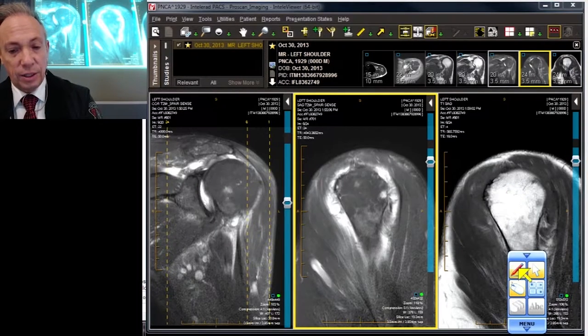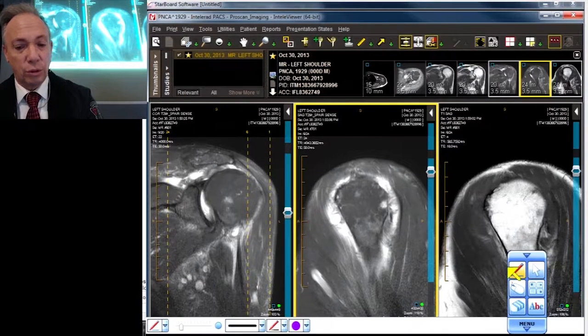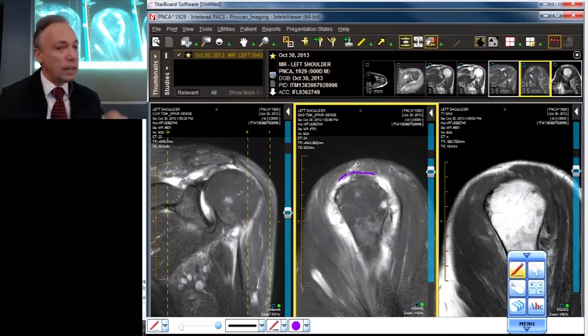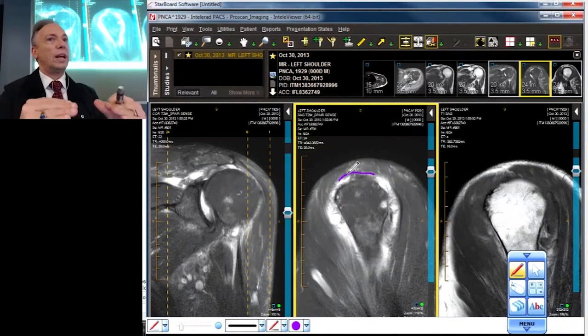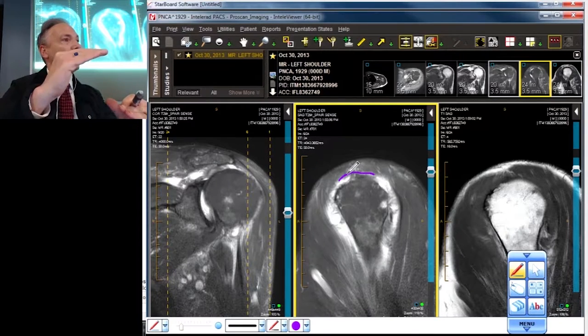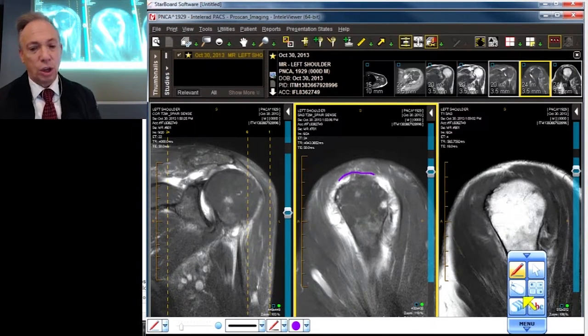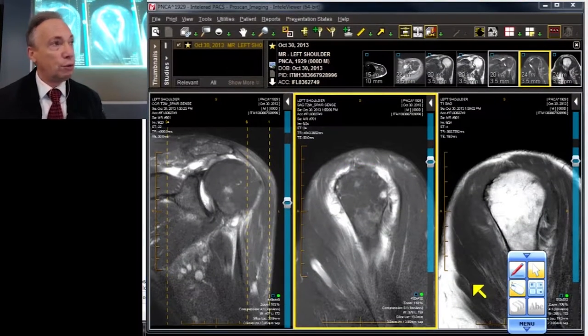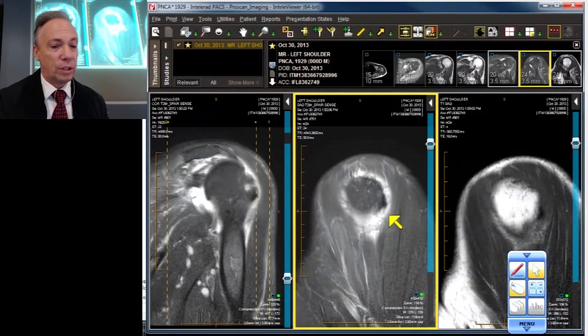One potential pitfall you've got to be very cognizant of is the underbelly or undersurface of the deltoid. Sometimes you'll see a little bit of coalescence of that tendon — not in this example — but if the deltoid is sagging down or sitting down on the humeral head, you're actually looking at the deltoid tendon and you will confuse it for an intact cuff. It happens all the time, so don't get fooled by that.